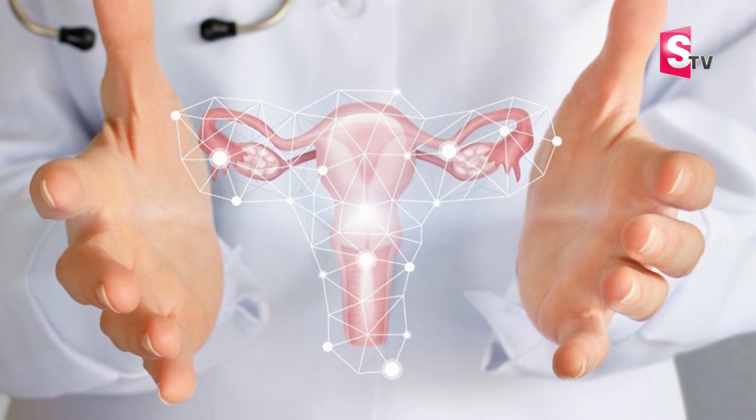So these are the gynecological indications for hysteroscopy. Sometimes even for sterilization procedures wherein we can put spring-like equipment inside the tubal openings, we can perform it hysteroscopically. So this is about the gynecological indications.